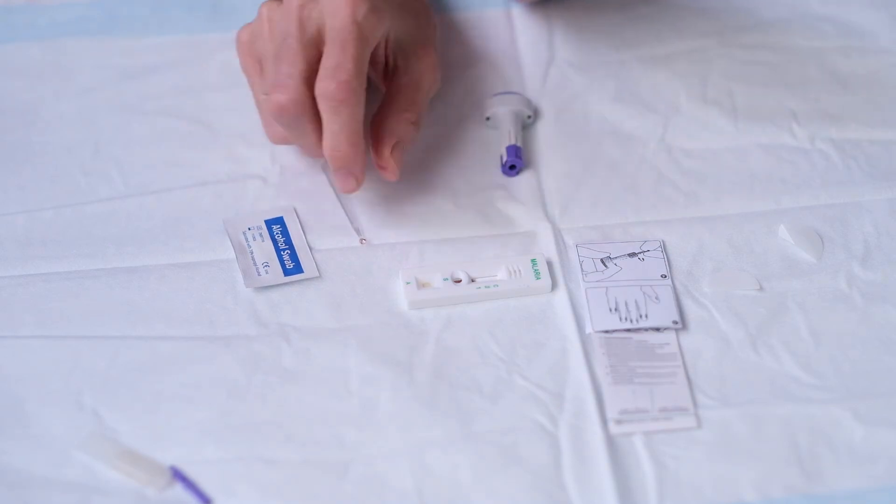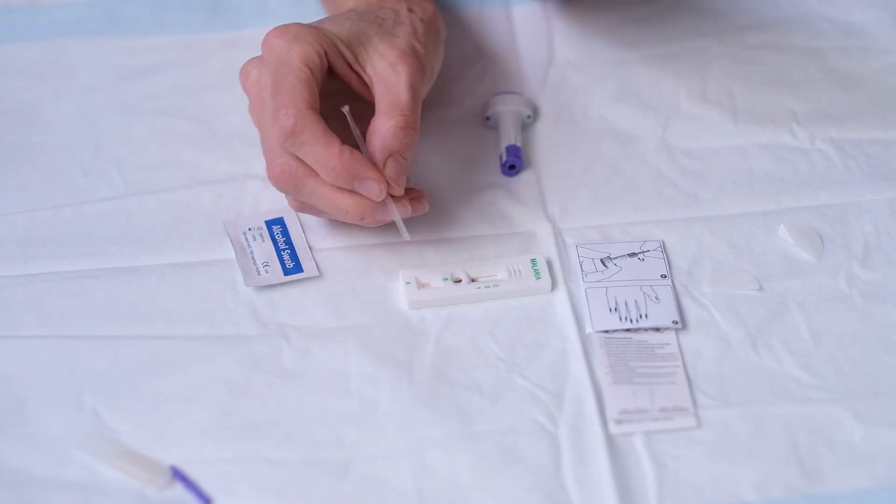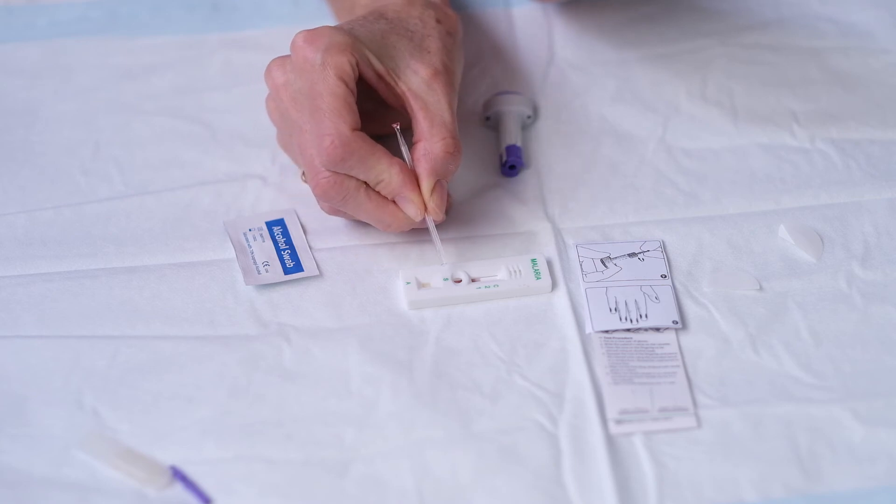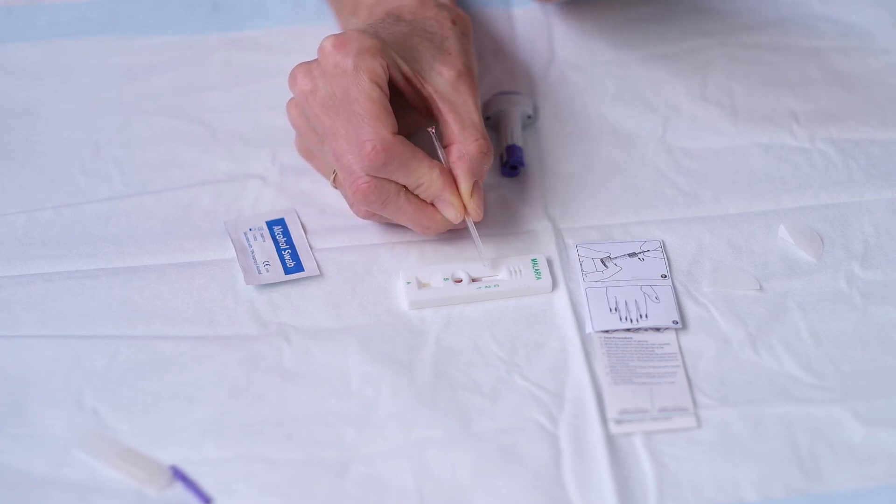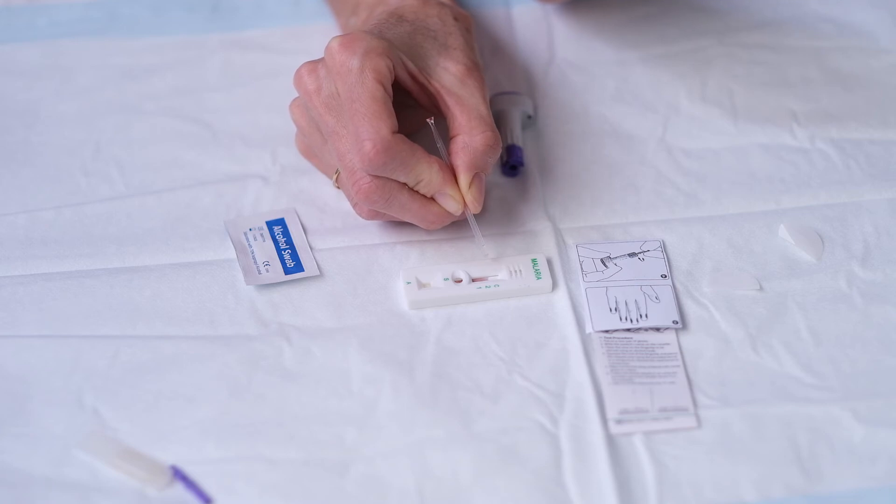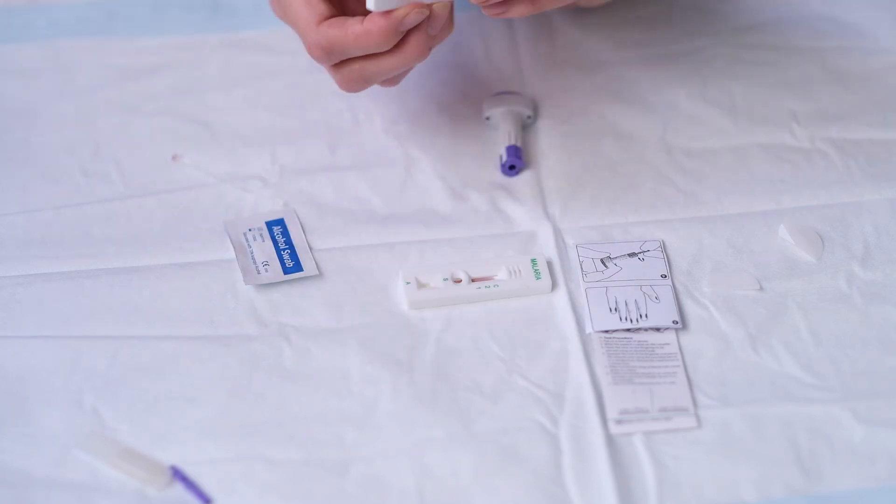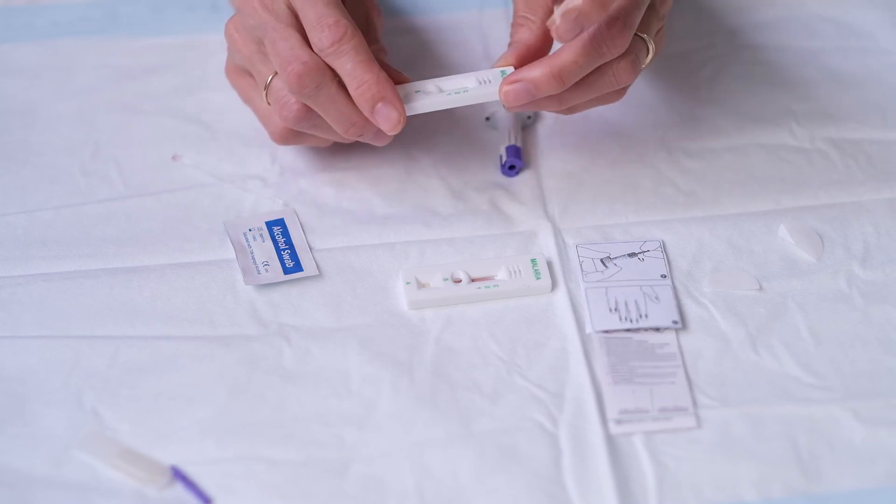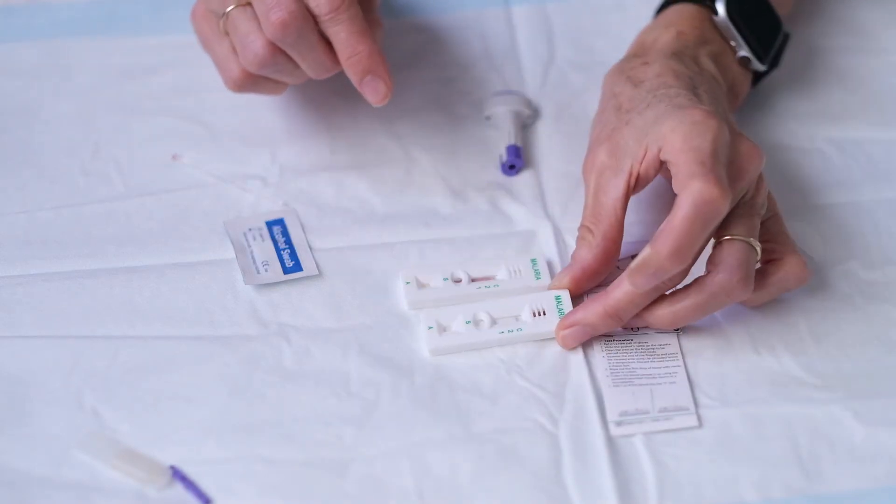And what will happen is that the solution will run past the blood up through the card and it will tell you by small bands on the cassette whether or not you have malaria. C is the control band will show that the test has been done correctly and this is a test that we did earlier.